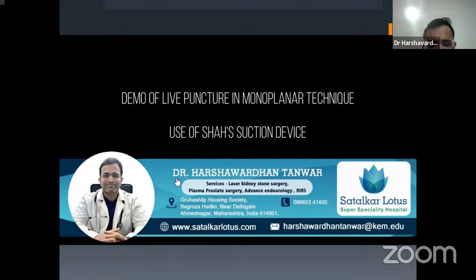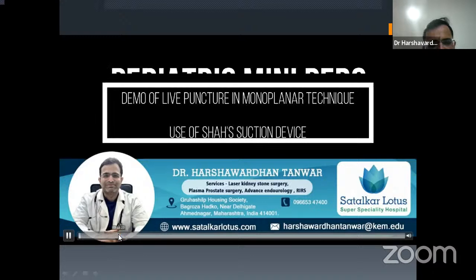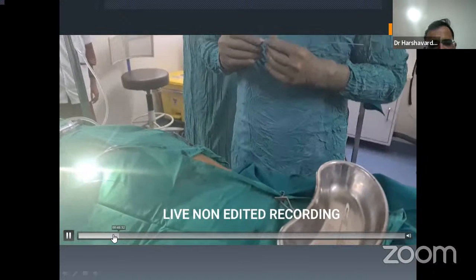So now let us come to the live video demonstration. It's a semi-live video demonstration of some cases which we have done in monoplanar technique. With this video, I will try to tell you what is the technique of puncturing the kidney in a monoplanar manner. Showing the demonstration of the kidney.